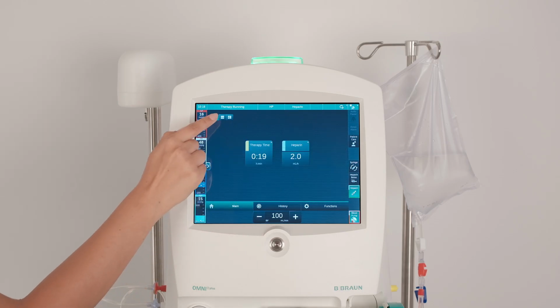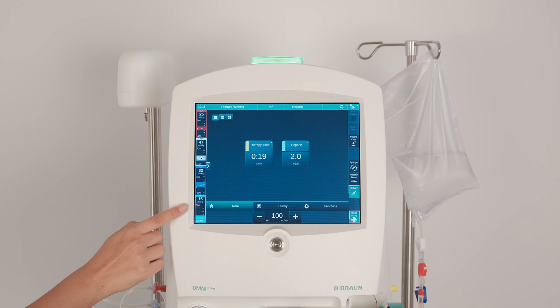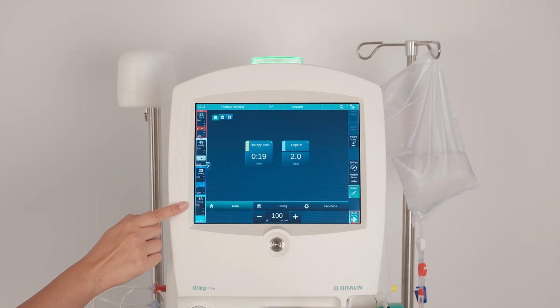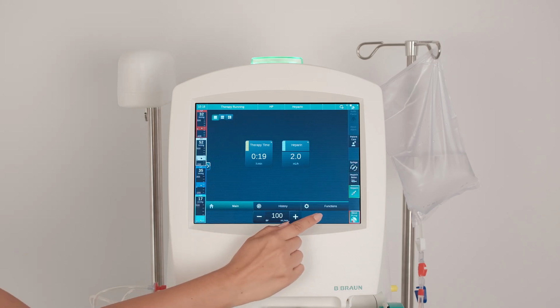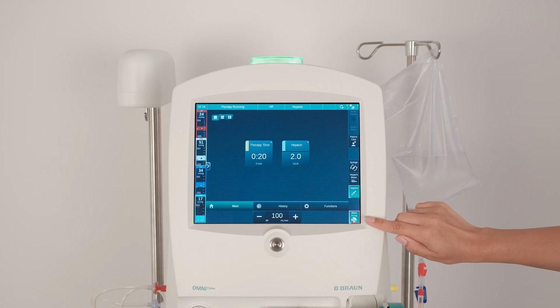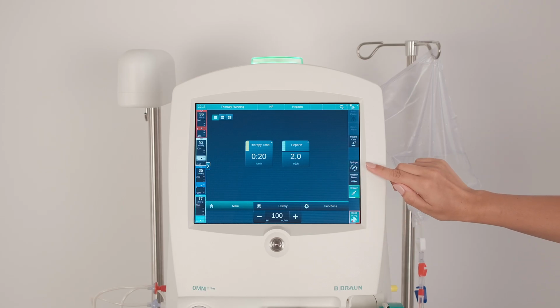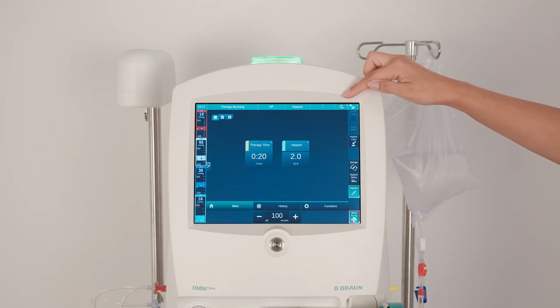The key parameters highlighted on the main screen from the left to the right side are pressures overview, AP, FP, VP, PD. Menu bar at the bottom: Main, history, functions, blood flow. Key icons: blood pump, heparin, heparin bolus, syringe change, patient care, other settings.